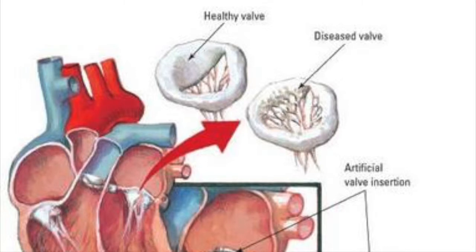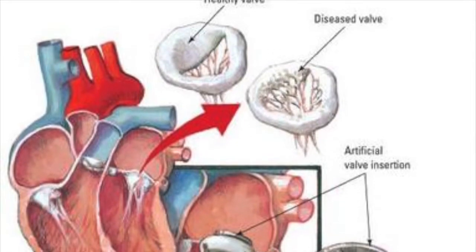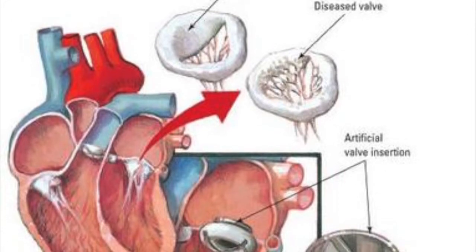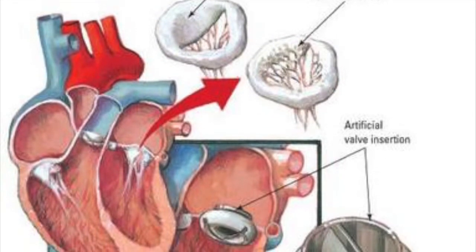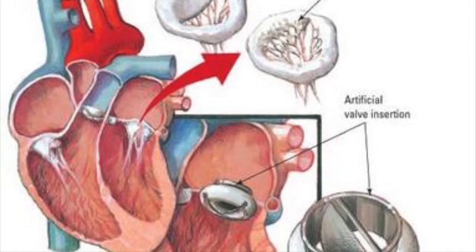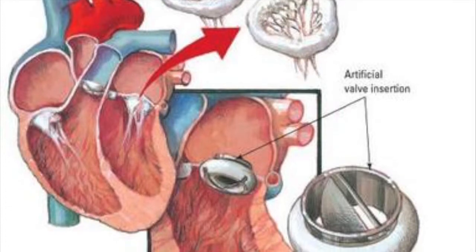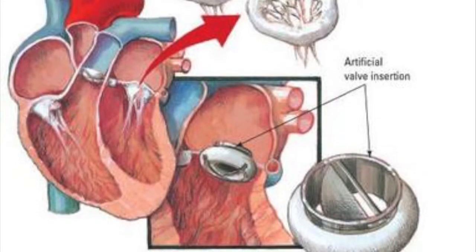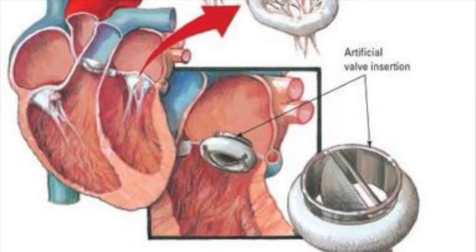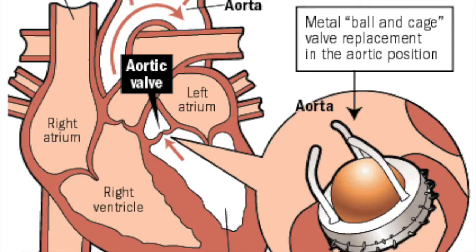The production and utilization of heart valve replacement first began in the early 1950s. Its purpose is to assist patients with valvular heart diseases. The ideal replacement for diseased valves must be able to mimic native valves, meaning they should have quality hemodynamics, aka blood flow, long durability, high thromboresistance, also known as blood clot resistance, and excellent implantability.